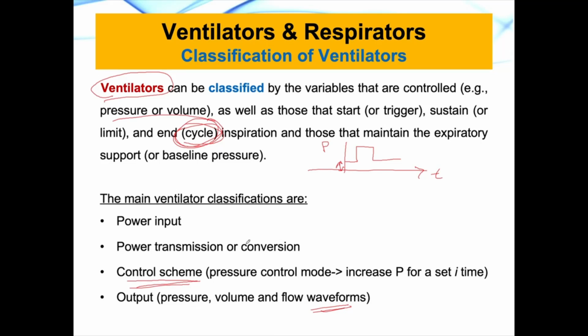But before we go into the classifications and understanding how we control a ventilator, or how we control respiration through a ventilator, I would like to show you this schematic.